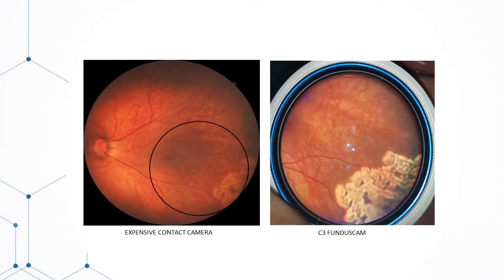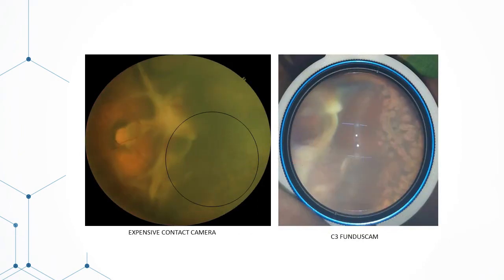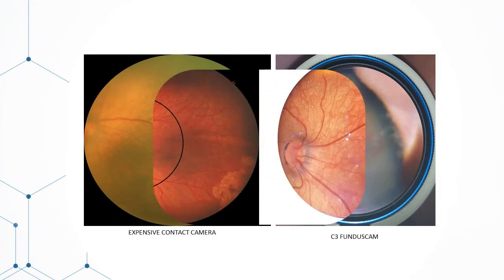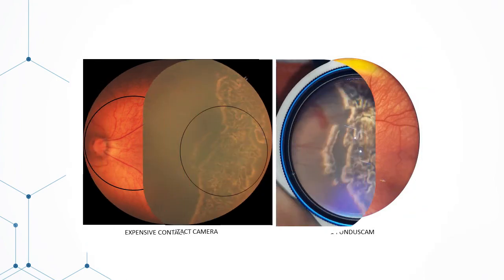These are a few comparative images between expensive contact cameras and the C3 Fundus Cam. You will notice that we are able to capture images of the retina up to the extreme periphery. The smartphone images are true color images and give a sense of depth and a 3D effect from an image quality point of view.